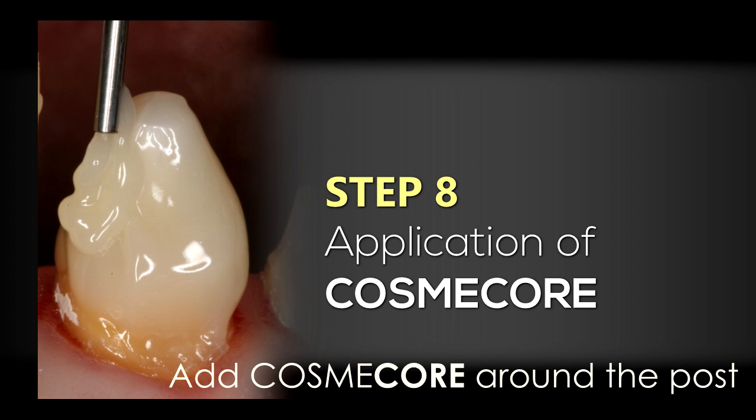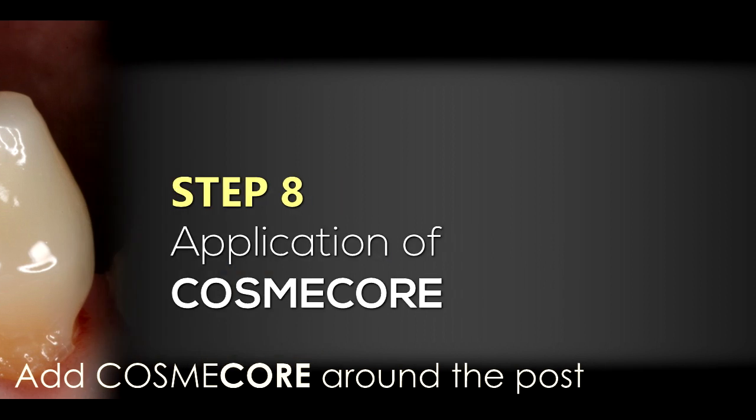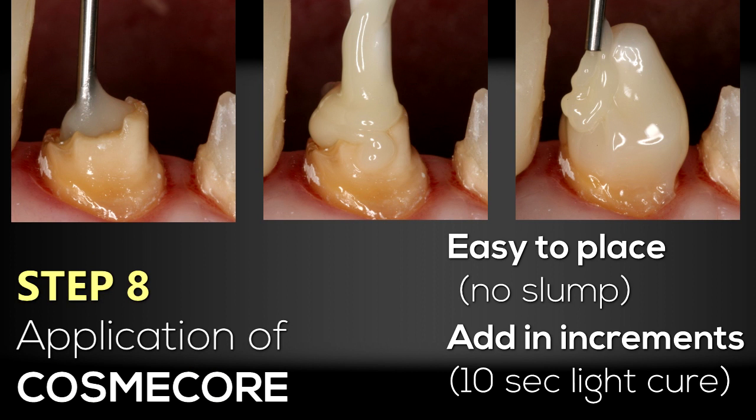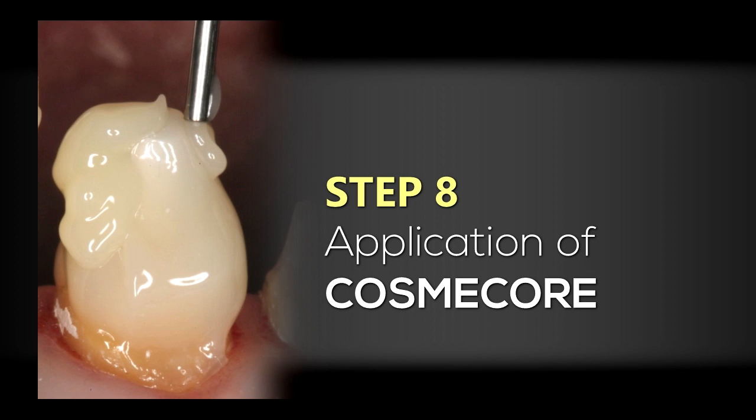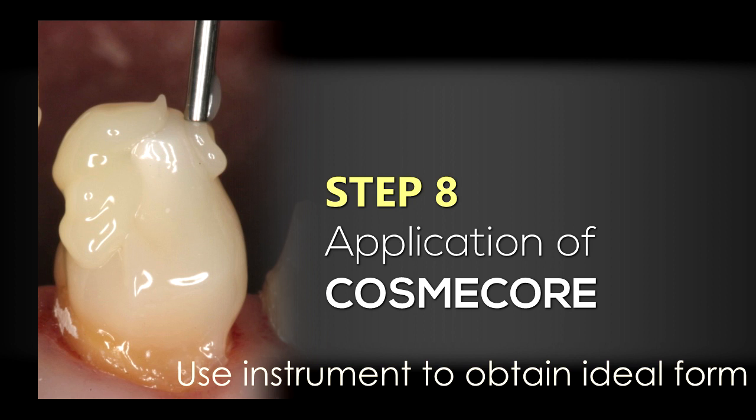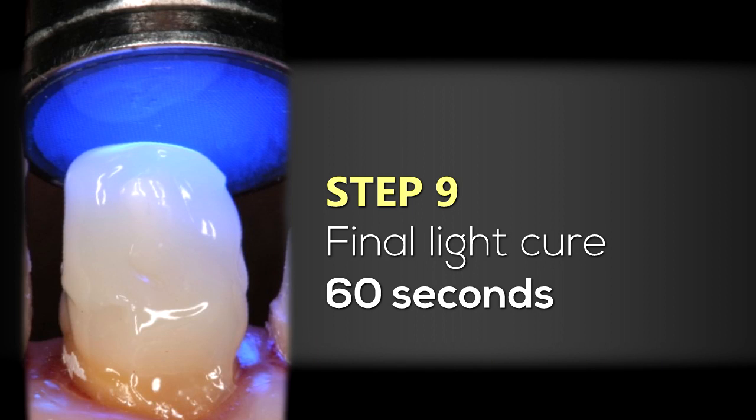Now I'm going to start adding more Cosmocore around the post. What's really nice about Cosmocore, as you'll see in the photographs, is that there is very little slumping — it flows very nicely, it's easily placed, and I don't have to worry about slumpiness of the material. One of the other advantages of Cosmocore is that I can light cure it in increments: I can add some Cosmocore, light cure for an initial 10 seconds to hold its position, then continue adding Cosmocore to create the proper form. I continue adding to seal all the way around the post, and I can use an explorer or instrument to get a more ideal form before the final light cure.